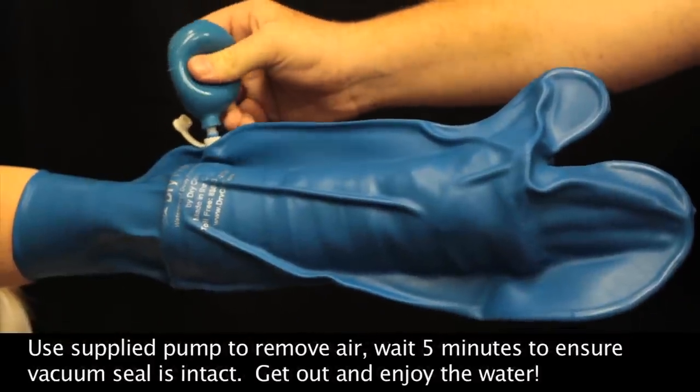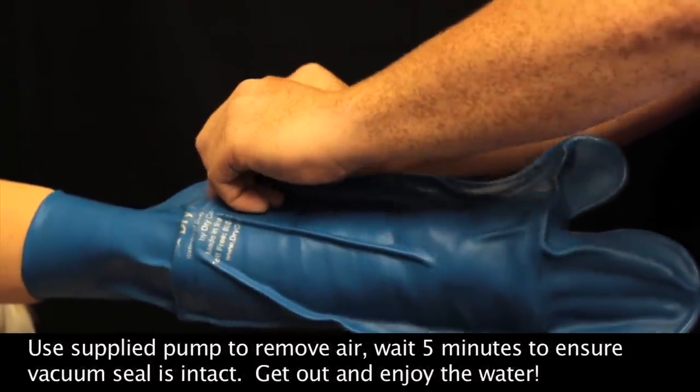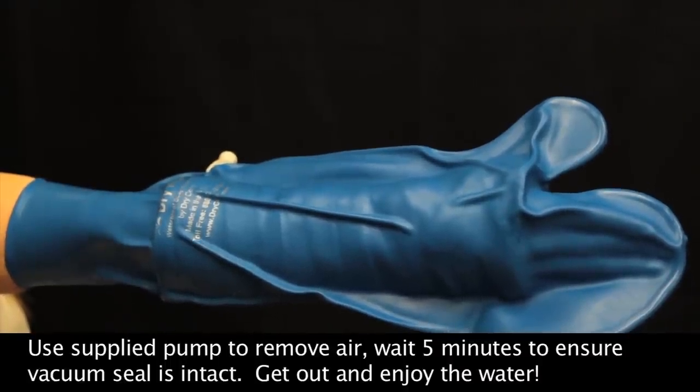Using the supplied pump to remove any excess air from the arm protector, wait about five minutes to ensure that the vacuum seal is set. When the vacuum seal is set, you're ready to get out and enjoy the water.